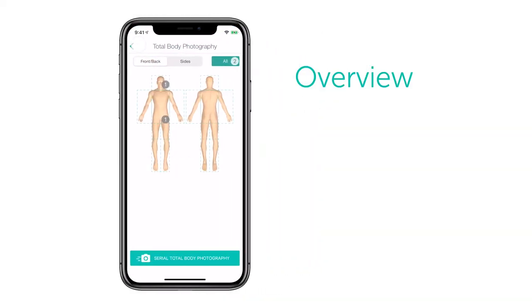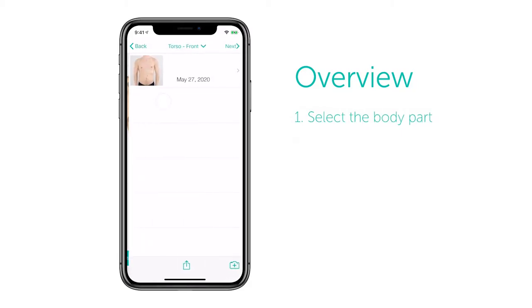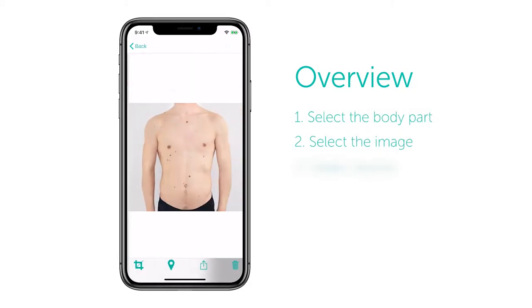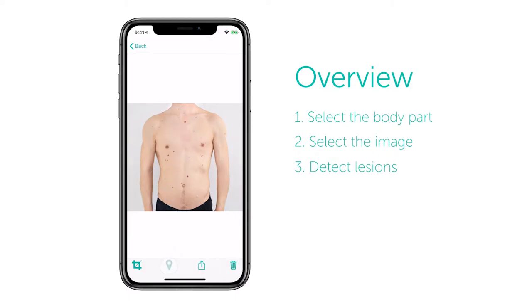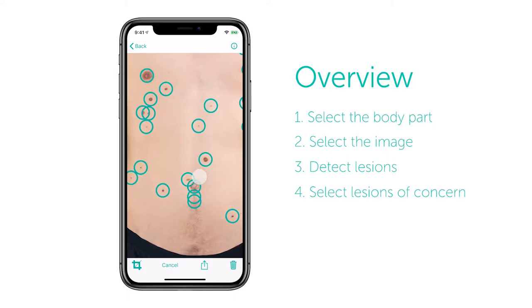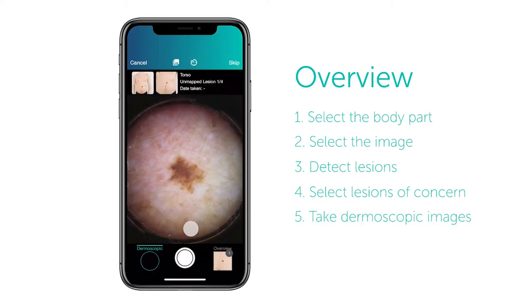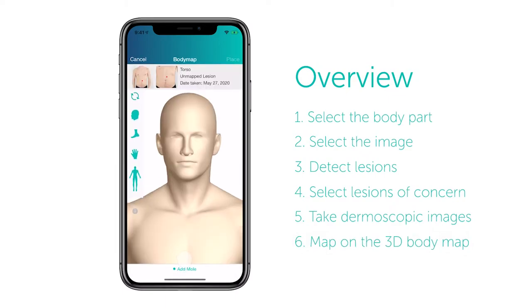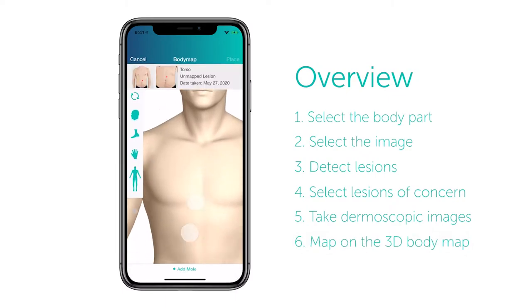Let's run through this process one more time. Step one: select the body part. Step two: select the image. Step three: detect lesions. Step four: select lesions of concern. Step five: take dermoscopic images. Step six: map to 3D body map.